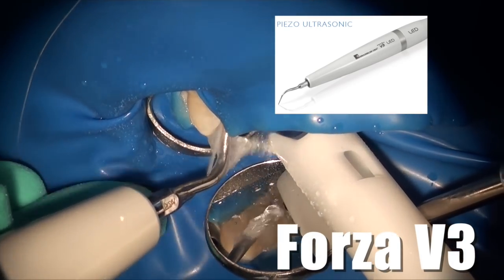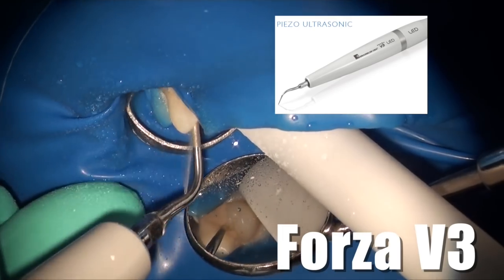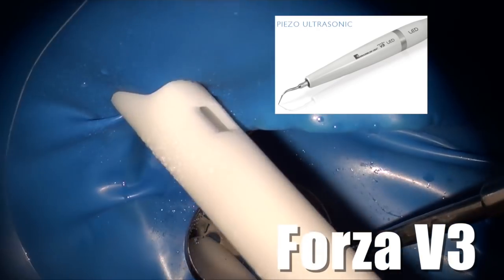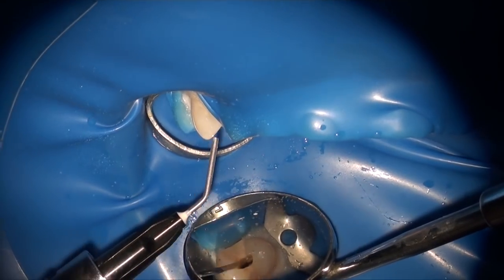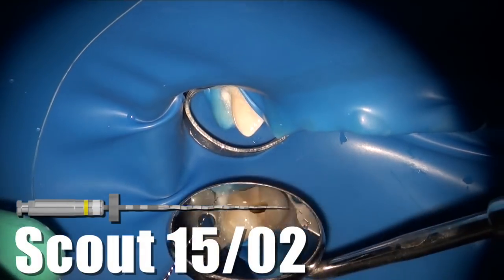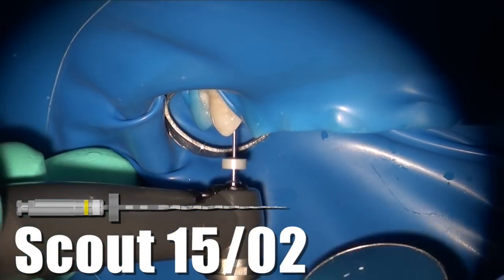Every time I do a couple of rhythm motion strokes, I proceed to use the ultrasonic and water. What this does is remove any loose debris that's in the canal, and then we add sodium hypochlorite to turn the water into bleach again. We dry the top part of the tooth so that I can use my Scout 1502 to measure the working length.